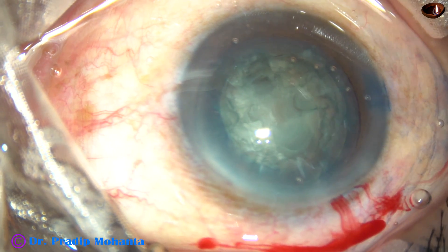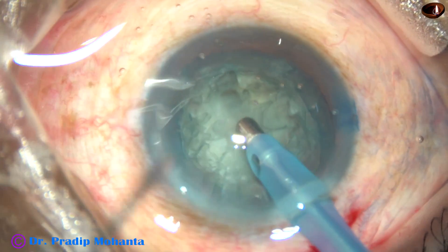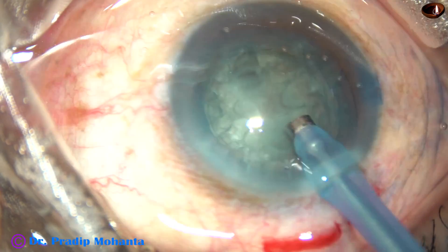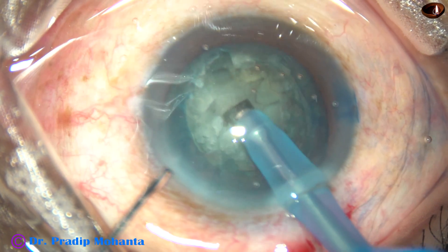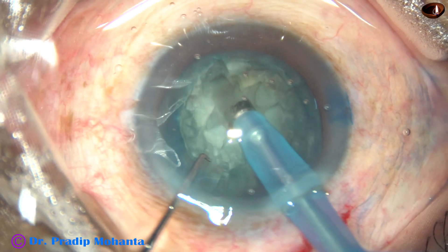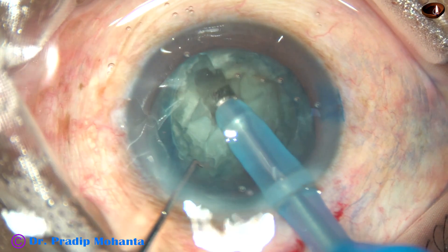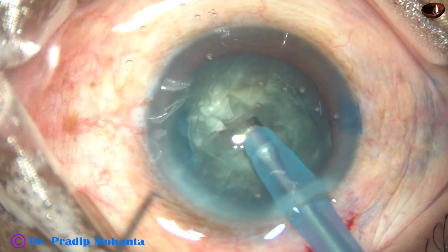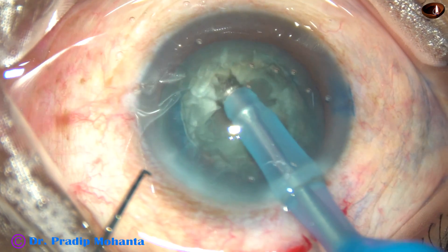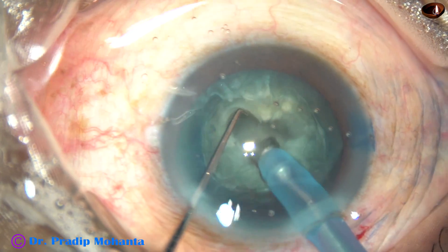At this time I had to come out because the bottle had to be changed. Now I go again, and I have to make these trenches deep. You can see faint red glow at the floor of the trench. Now the trench at 90 degrees — it also has to be of the same depth.